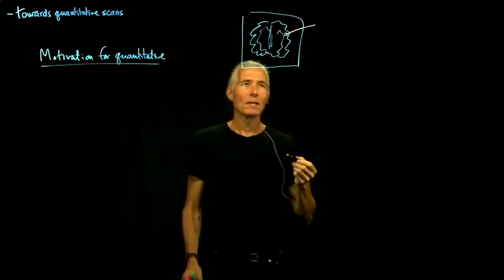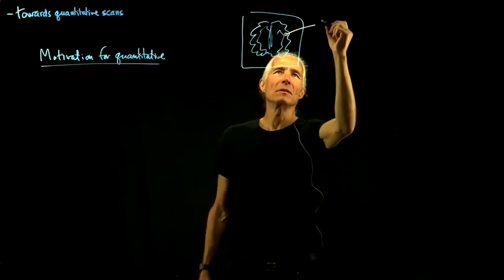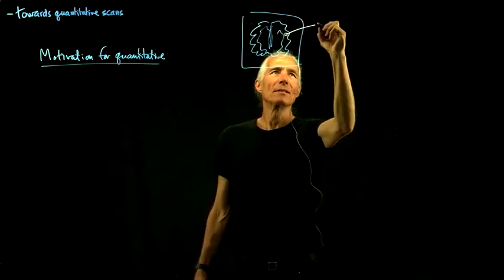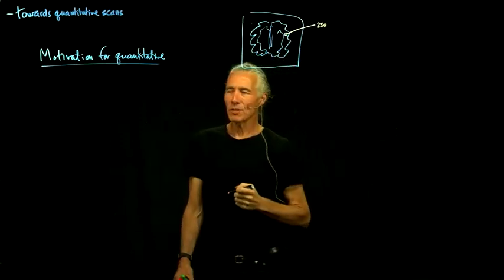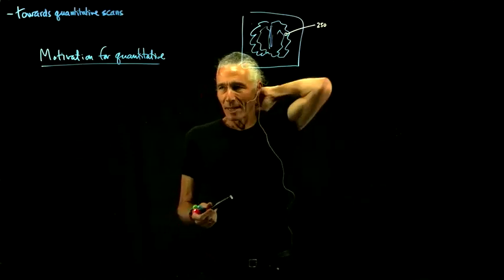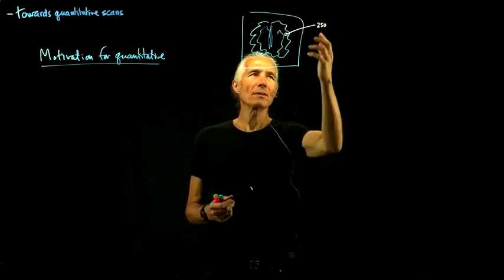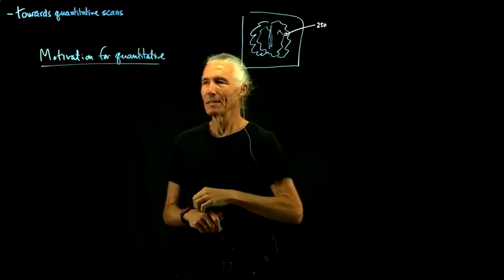On our scanner, that number for gray matter might be, say, 250. But if you take that same person, stick him in the magnet, and do another scan a week later, you'll get some other number. It'll be maybe around 300.